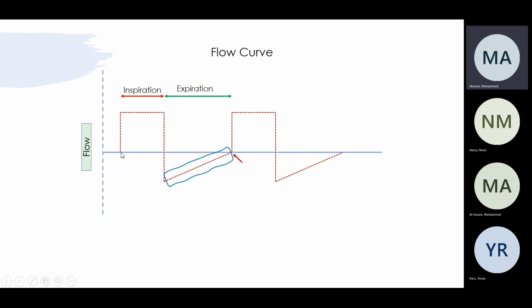The flow, when we inhale, the flow goes straight. So is this normal? If me and you right now take a graph to give me exactly the flow while I'm talking and breathing, does it look square like this? No. How do you think it will look? So it will go to a peak and then slowly decelerate. Is that right? That's how it usually is.